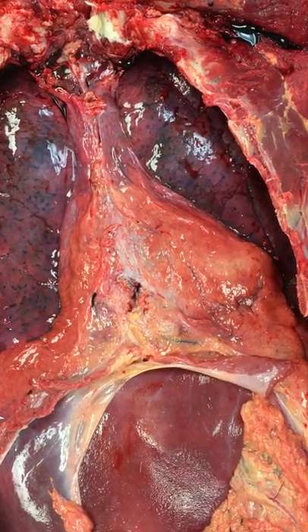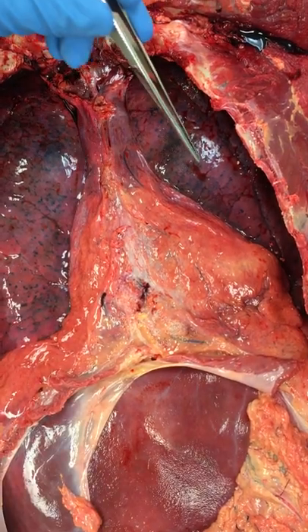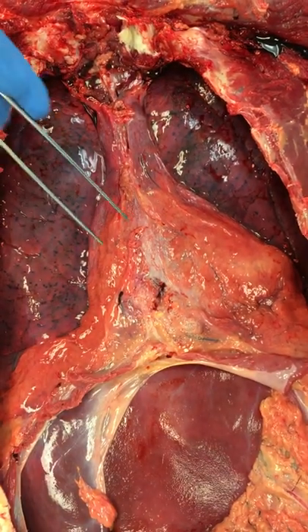Okay, this is the thoracic cavity after the sternum has been taken off. This is the left lung, this is the right lung, and this is the sac that covers the heart called the pericardium.